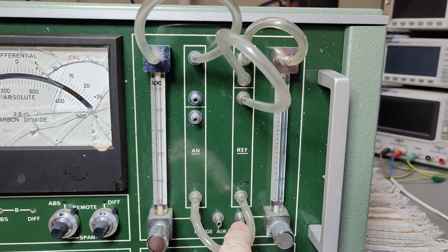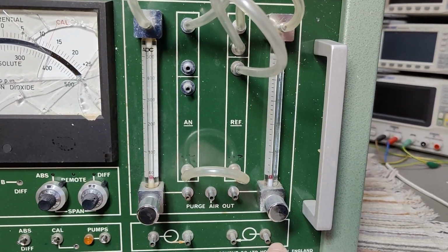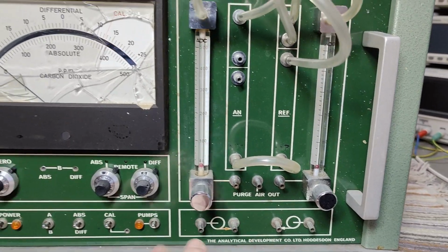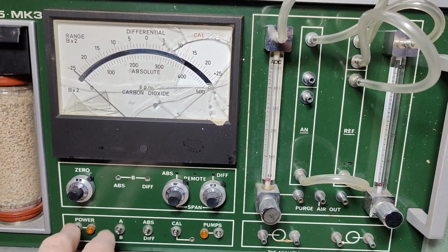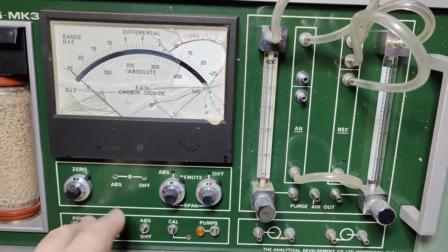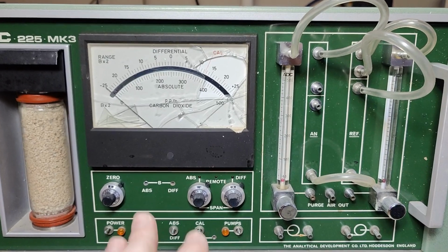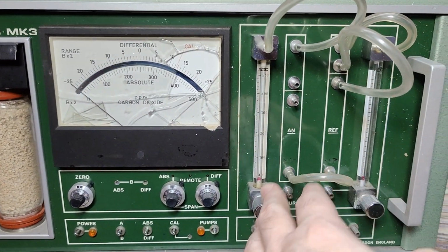So you got a reference and you got a measurement, and you can purge the air in and outputs here, probably some valves and such. And of course we can select some pumps, A, B, so we have some reference. I think this is the whole idea. It's a differential between two different things.